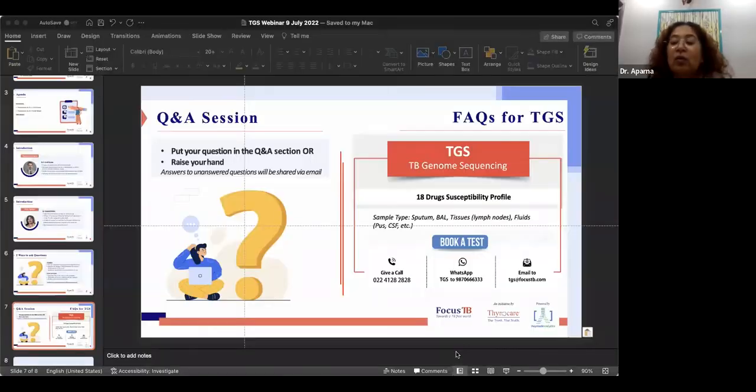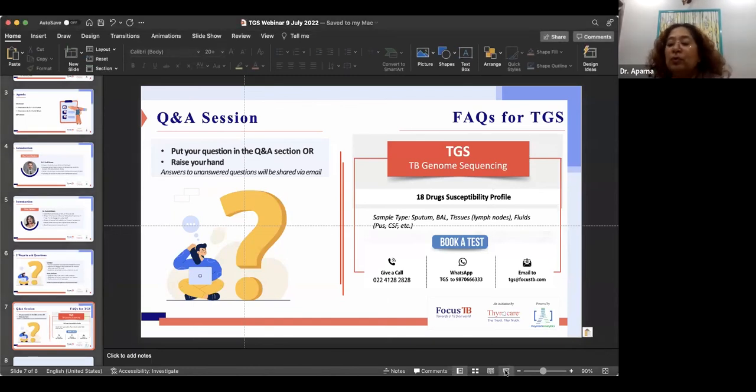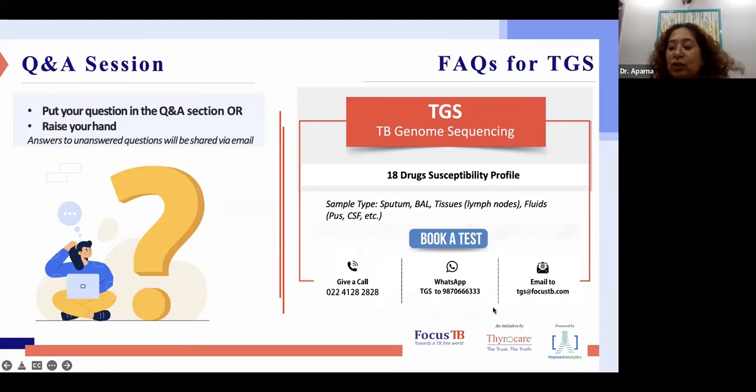I will just add my two bits at this point: WGS will definitely be able to tell you whether it is an NTM or also tuberculosis. Having said that, if there is a mixed infection with two or more lineages of Mycobacterium tuberculosis, it will be able to identify them, like you've already said, but it will give a combined resistance profile.